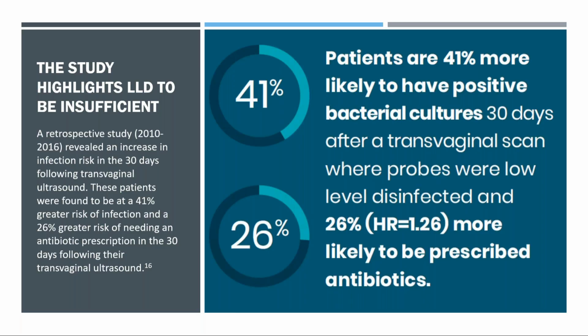It's not just a laboratory finding that these probes might have, and certainly do have, pathogenic bacteria or viruses after use in a patient with probe covers and low-level disinfection. But clinically, there is a substantial risk to the patient of acquiring an infectious disease requiring therapy.